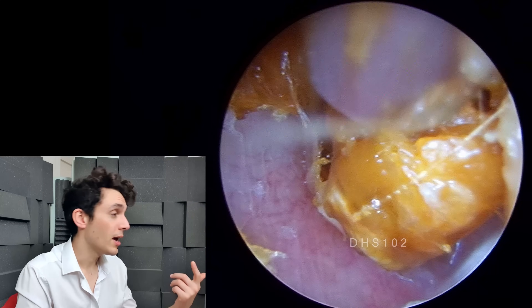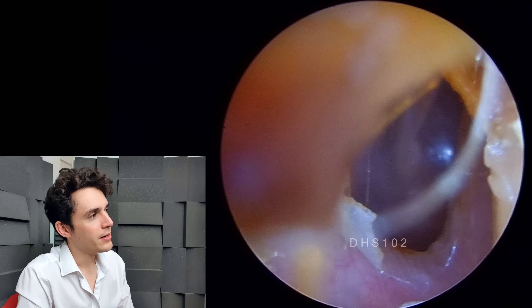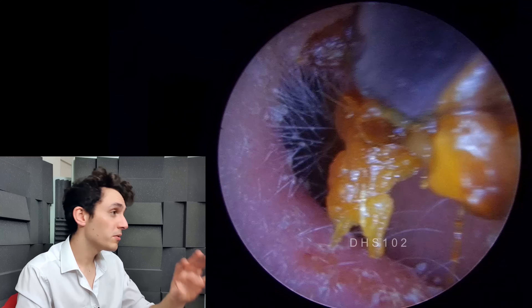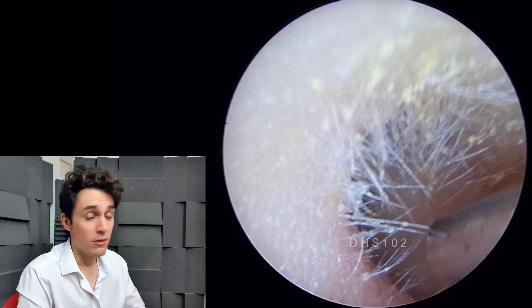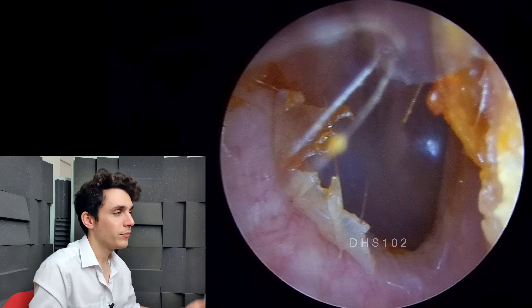I wouldn't say there are any hallmarks here of infection — swelling, redness, pain, and so on. This is a fairly normal ear. What we're doing here is just cleaning up, quickly removing some debris so that we can visualise the eardrum. And then I'll show you the swimmer's ear, or the infected ear.